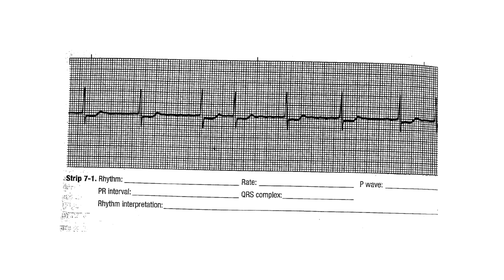Looking at this one, the rhythm is considered irregular - the R to R is irregular. For the rate, we use the six-second strip, counting the number of R waves between your six seconds. You have six, multiply that by ten, so you have a heart rate of 60. For P waves, you do not see any P waves - they are fibrillatory waveforms along the isoelectric line, so we cannot do a PR interval.